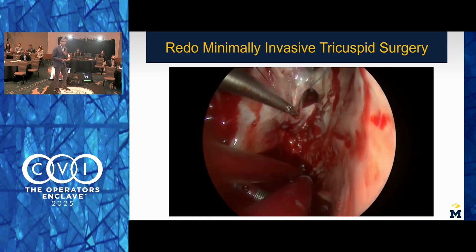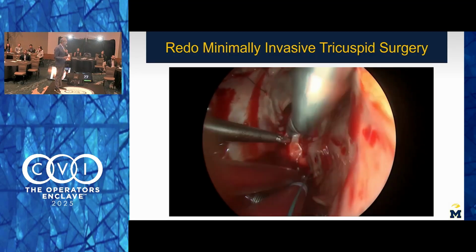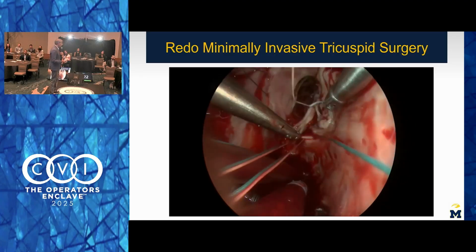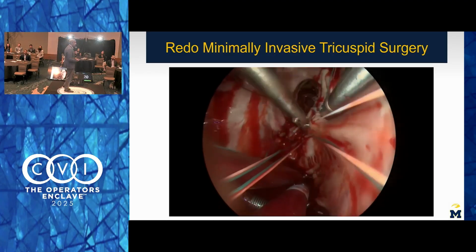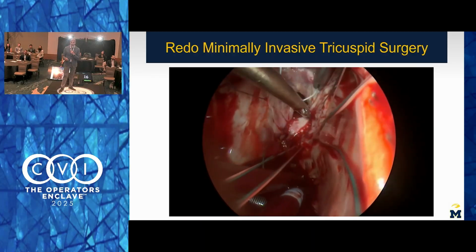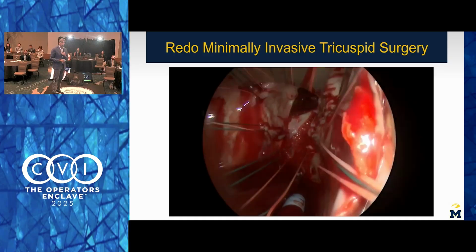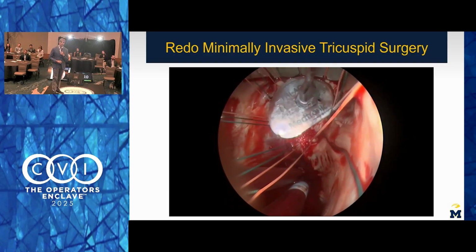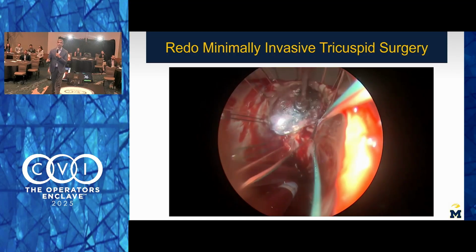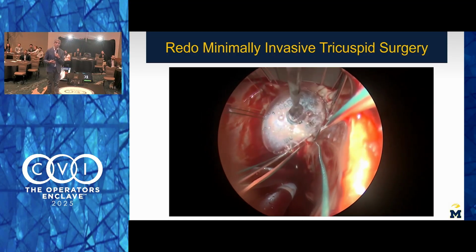The nice thing is we're not under a lot of time constraint, so we went ahead and put annuloplasty sutures in. One thing that's a little different: because he had a pacemaker in, we could be a bit more aggressive about how much of the valve to enclose. We were traditionally taught to do a partial ring, and this is still a partial ring, but we essentially covered about 270 degrees because he's already pacer dependent, and we're not worried about the AV node and intentionally trying to downsize.